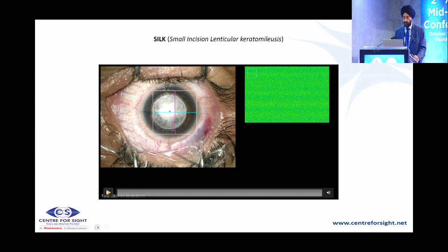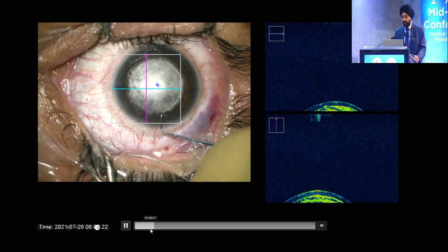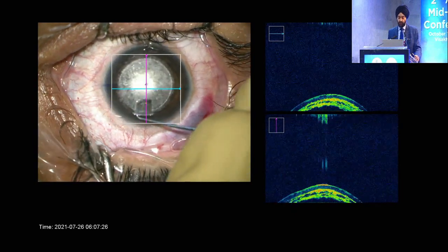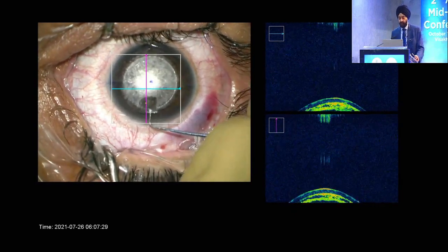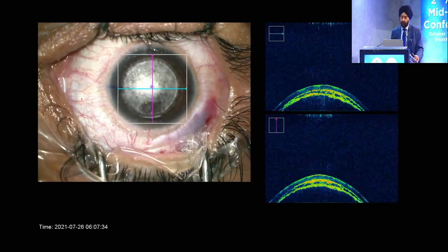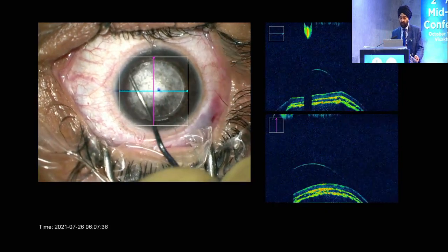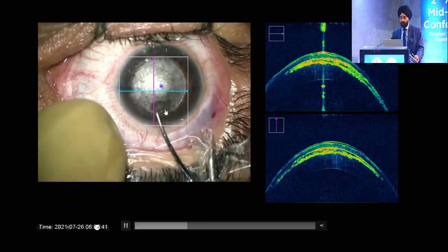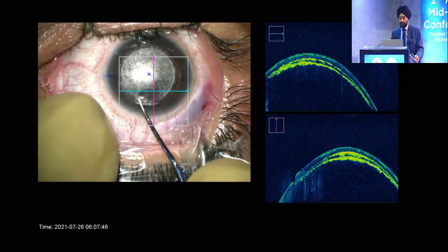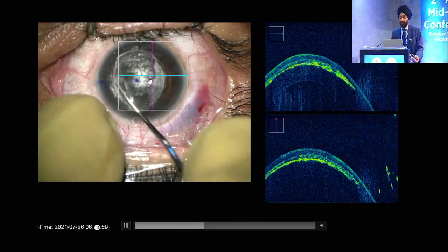This is how it looks, and we are going to show you an OCT guided image. You can see that the entry is very, very smooth, because if you saw, it goes over the entry, see how smooth it is. It goes about every 10 microns, it keeps going down, so it goes about 8 to 10 times. And then you can see here, this is the central mark that I was talking about. And you will see that the amount of dissection is negligible. You can see these side marks, and see there is hardly any dissection that you are doing.